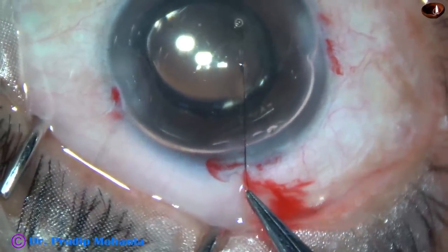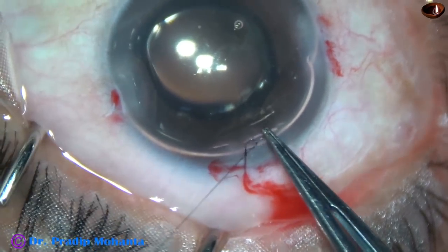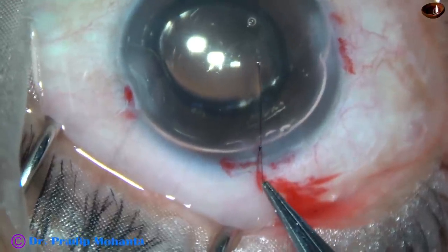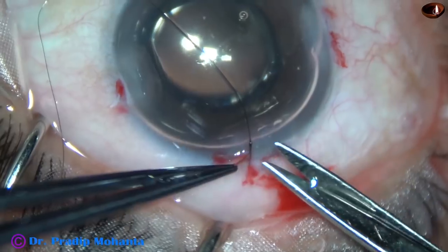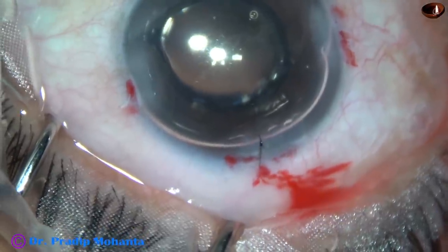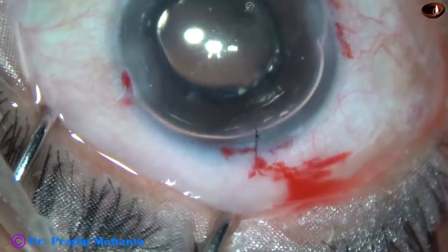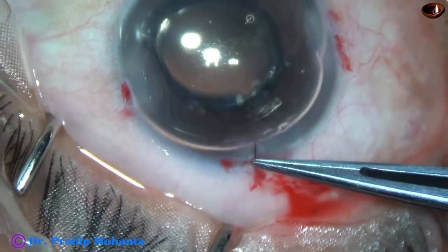And now trim the sutures, closed close to the knot. Then use McPherson forceps to hold this suture and bury the knot into the tissue.